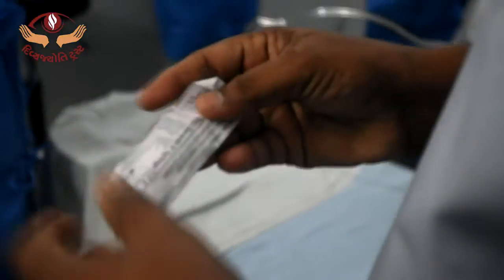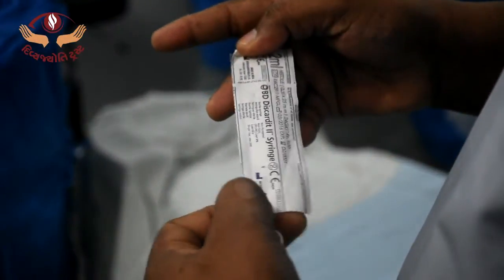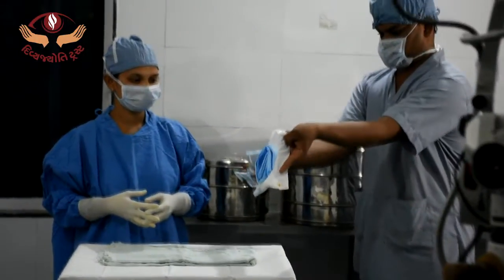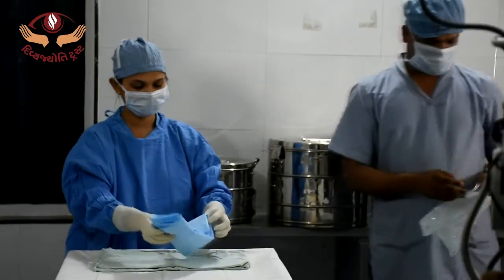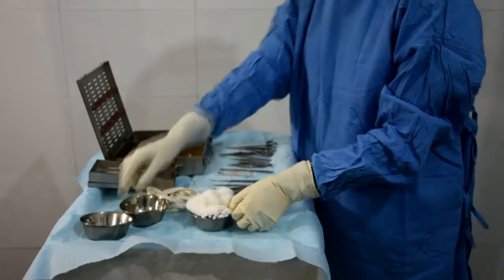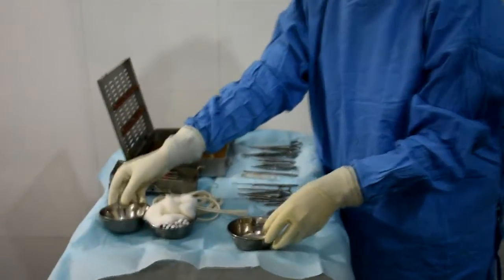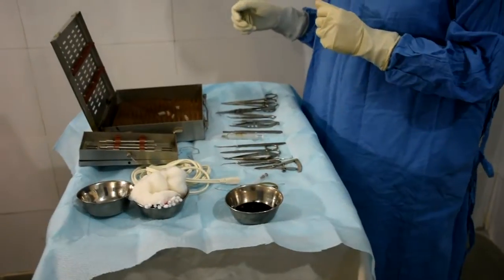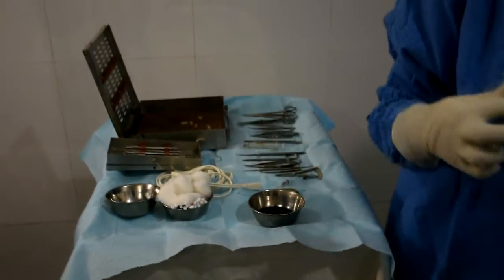Sterile packet is not used if the sterility is doubtful. Check the package for holes or breaches. Always check expiry date before opening the pack. Always open a sterile pack away from yourself, keeping fingers on the outside of the wrapper. When pouring sterile water, povidone iodine or while giving IOL, hold the container approximately 6 inches above the sterile field.